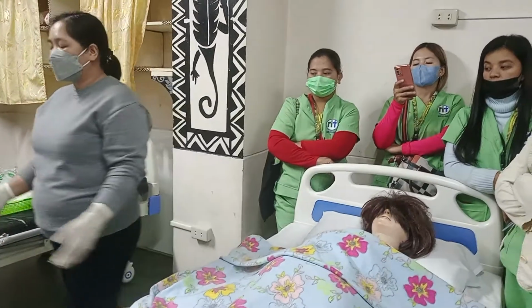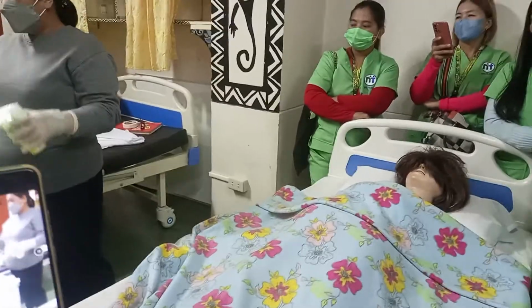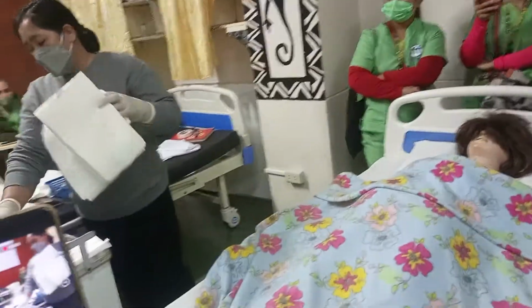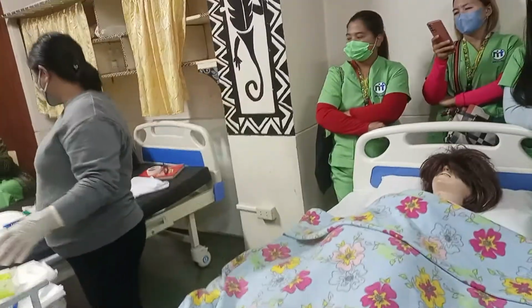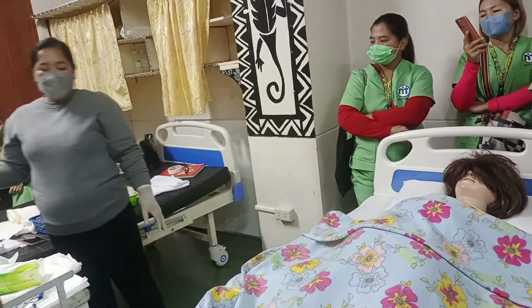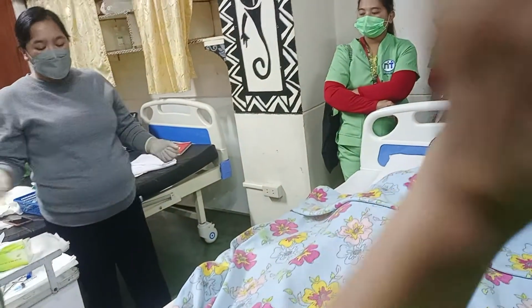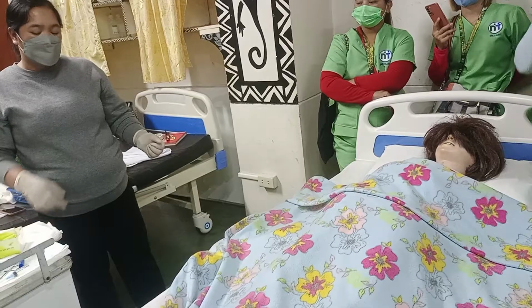So, go out, wash your hands, and then gather your equipment: a tissue, your underpad, and of course, basurahan. Okay? Then, I am now going to hold this one in a tray, and I will go back to the patient. 1, 2, 3.